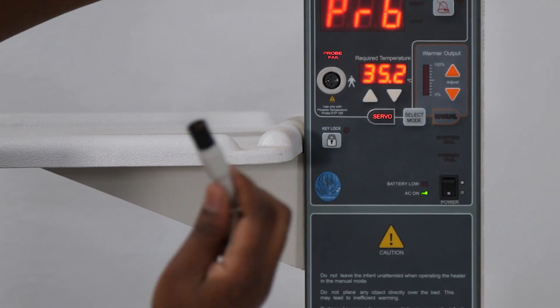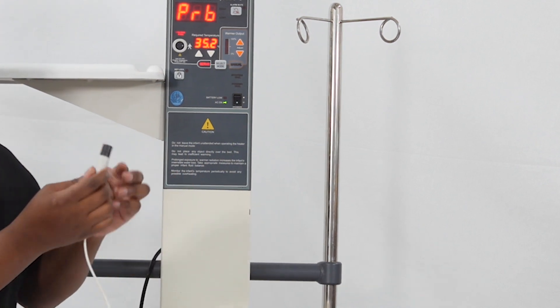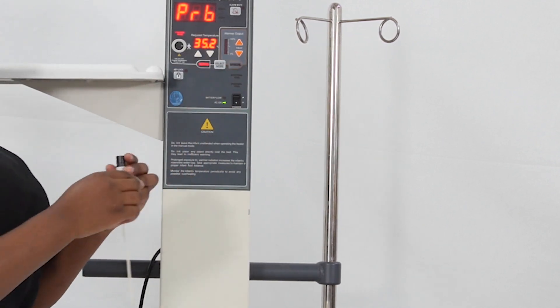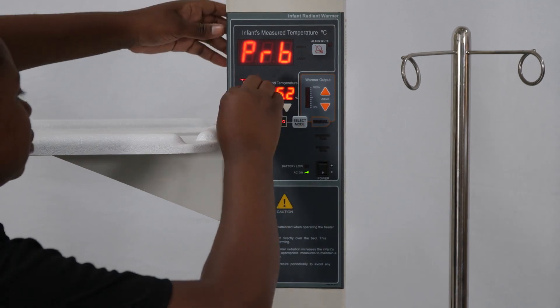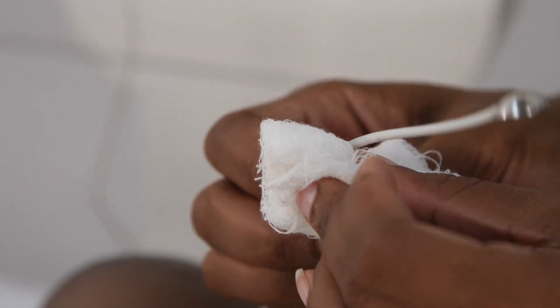The most delicate part of the warmer is the cord for the temperature probe. Be careful not to kink or bend the cord while you are using it. If you are storing these, do not bend or fold it.